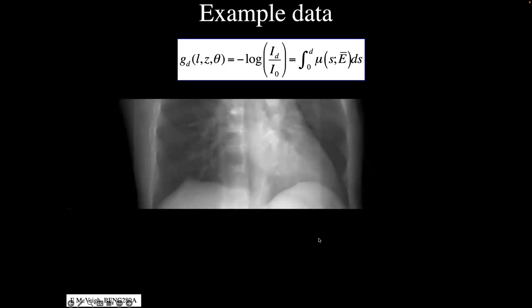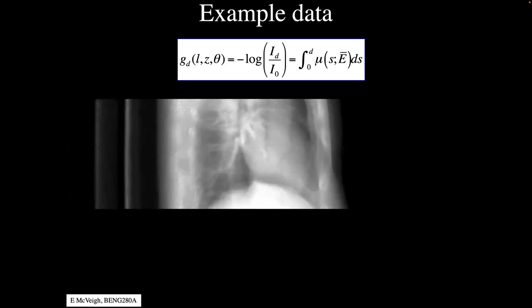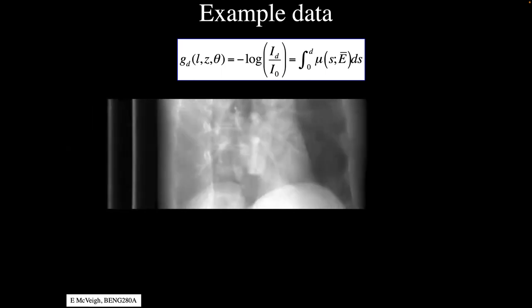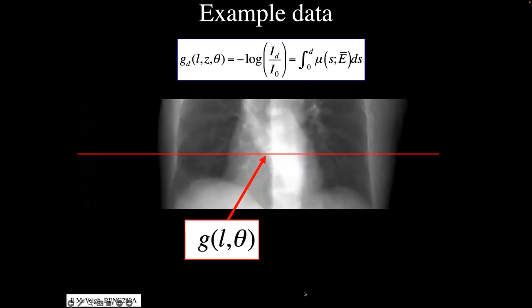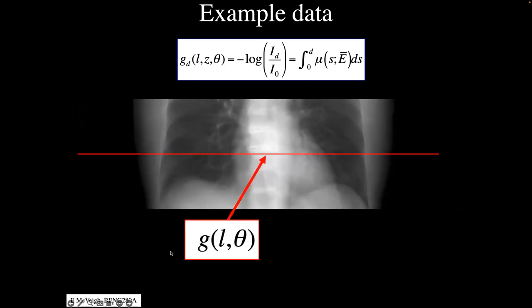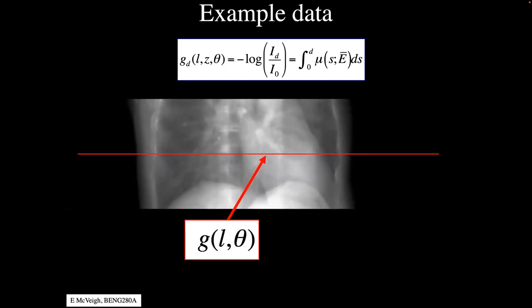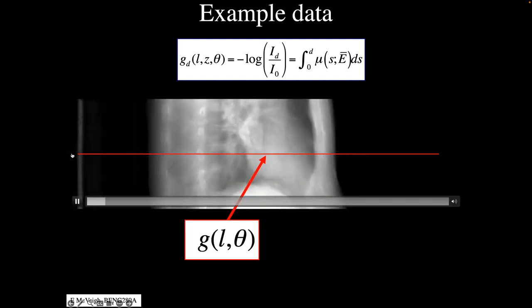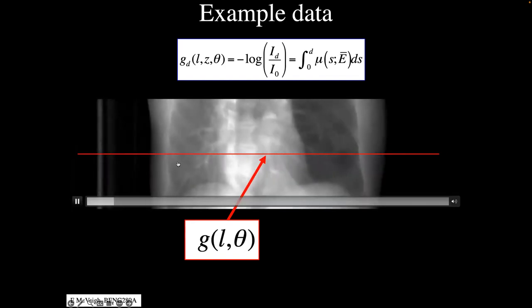So this is kind of neat, right? It's like 1,000 chest x-rays taken at slightly different angles, right? That's basically what it is, right? So for the rest of this lecture and pretty well the whole course, we're only going to focus on this thin red line here, okay?